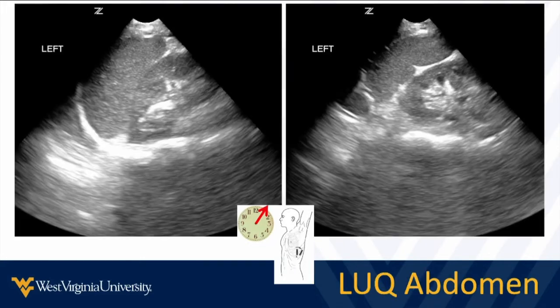Then we just work our way down the abdomen, again, fanning the transducer from ceiling to floor to examine these areas completely. And we're looking for fluid in those potential spaces. I also think it's important to point out that the spleen is a pretty small structure. So using your eyeballs, it should be about the same size as the kidney. It definitely shouldn't be bigger than the kidney. It should be nice and homogeneous, all pretty much the same texture. Should have nice crisp borders and good margins.